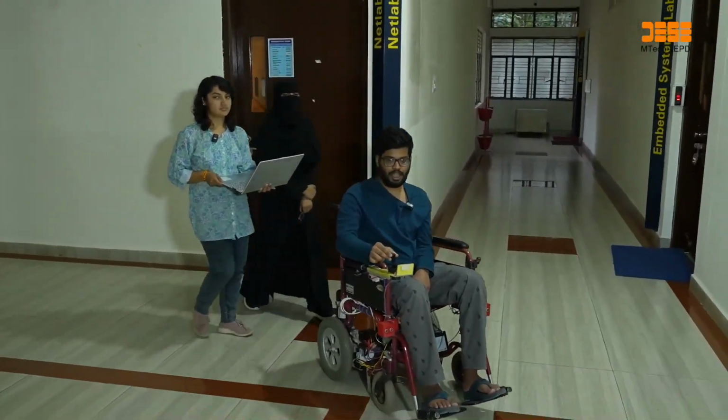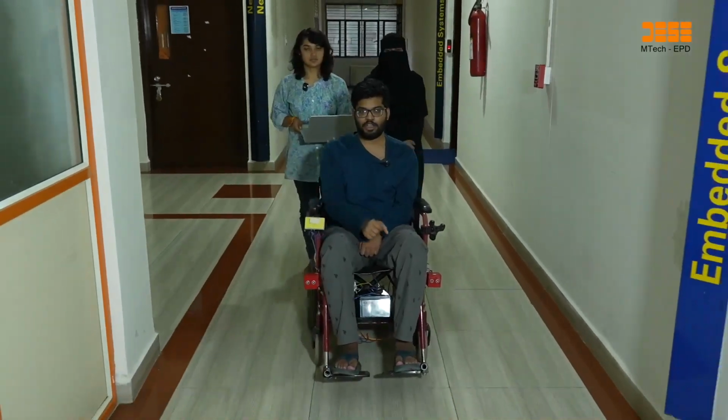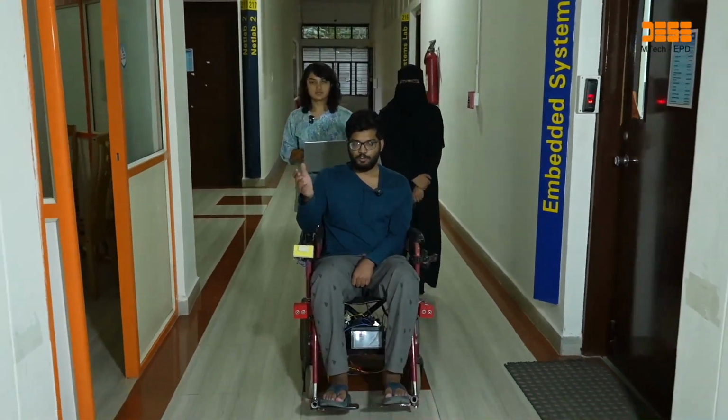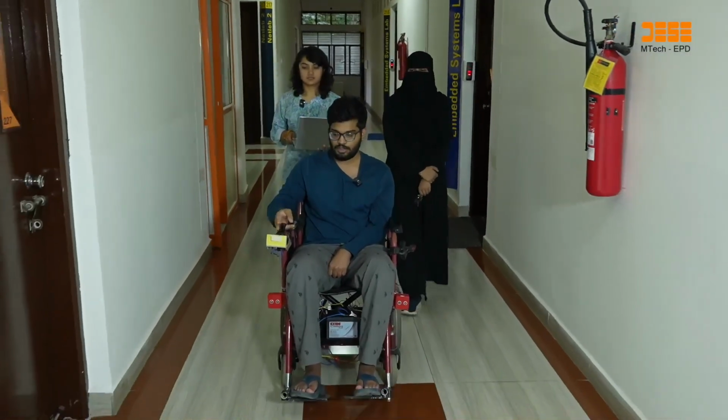So I have turned right. It is very smooth control. As you can see, I am moving the joystick. Now for movement of left and right and acceleration and deceleration, we need to control the joystick.